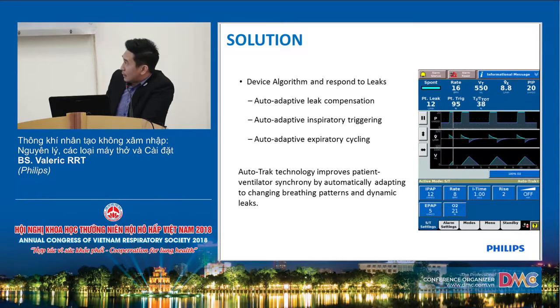So this one is basically adapting to changing breathing patterns and dynamic leaks. This one is a very efficient and very helpful feature in Philips during non-invasive ventilation.